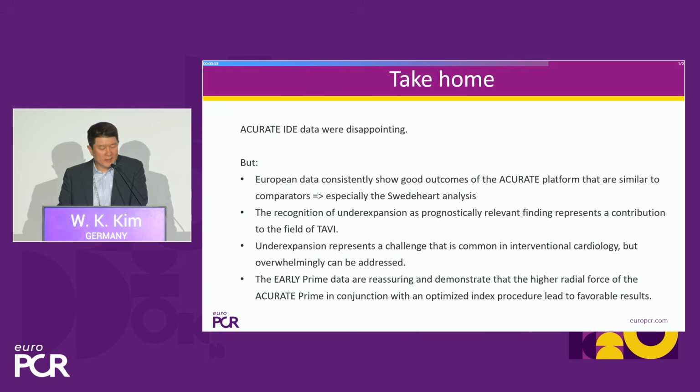Underexpansion represents a challenge. It is common. We are very familiar with the concept of underexpansion in interventional cardiology. But at least in the European data, we showed that overwhelmingly this can be addressed. The early Prime data are reassuring and demonstrate that the higher radial force of the Accurate Prime, in conjunction with an optimized index procedure, can lead to favorable outcomes.